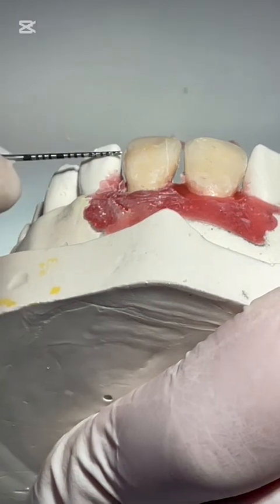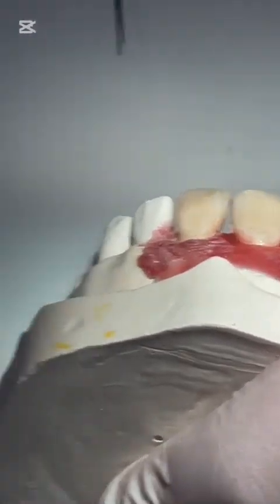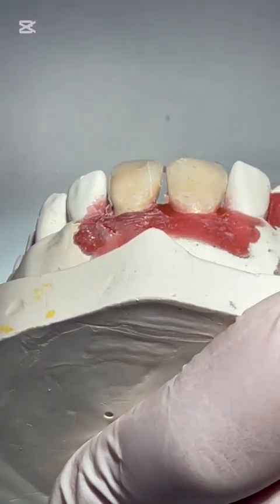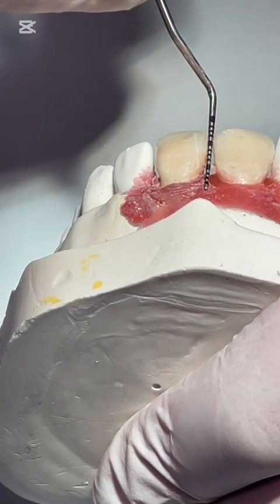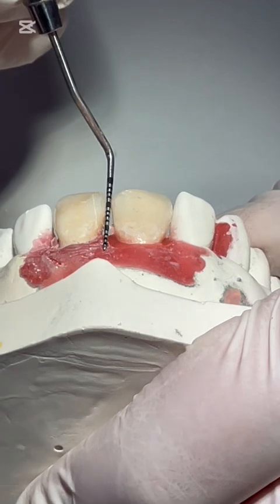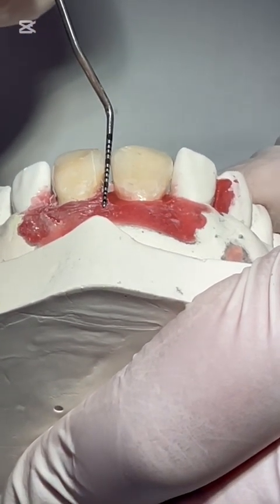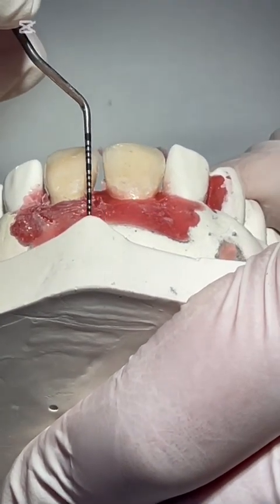It is about 1 millimeter plus 1 millimeter. So I have to make the two teeth similar to each other and to keep the midline in its place. Here is the midline. You can see that the midline is contacting the incisal edge of the right central incisor, right?